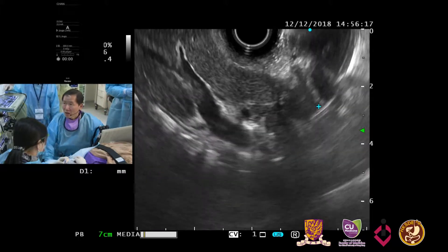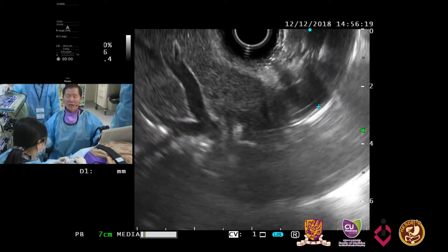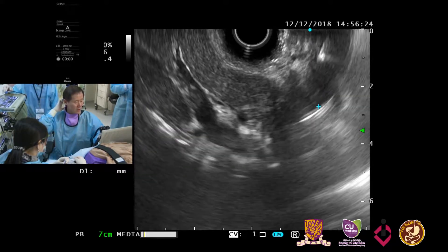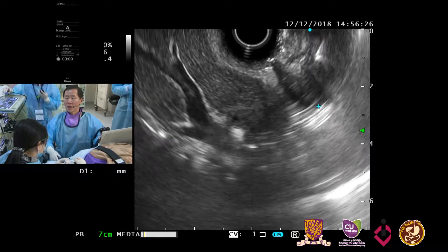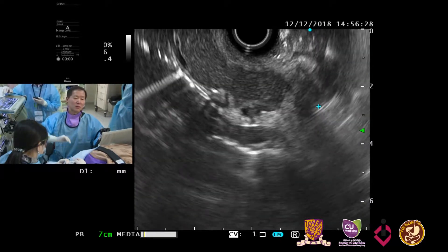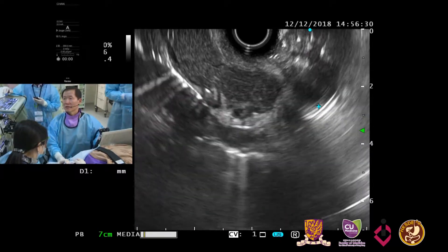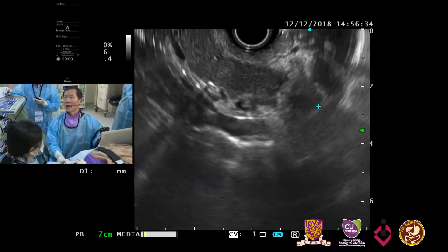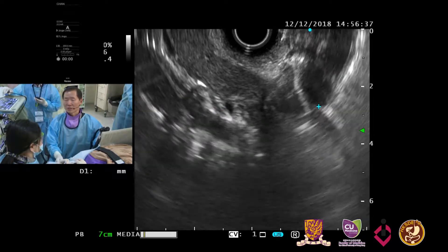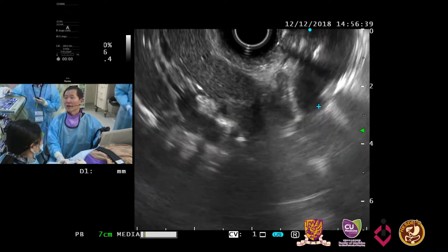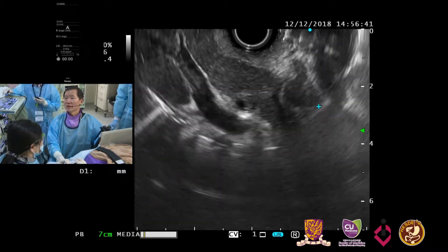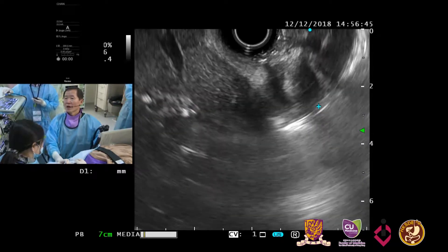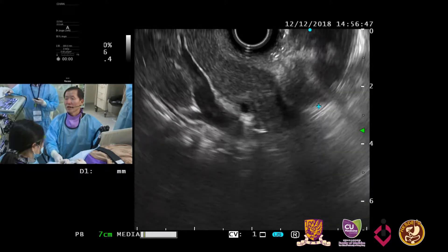In this case, I have difficulty in delineating. When I first started EUS, I clearly saw the caudate lobe S1 segment from the stomach side. But after repeated pushing and pulling, I think some air went inside the bowel also. So I'm having difficulty looking at the S1 segment from the stomach. Instead, I am trying to look at segment one from the duodenal side here.